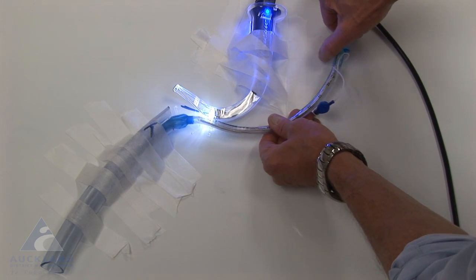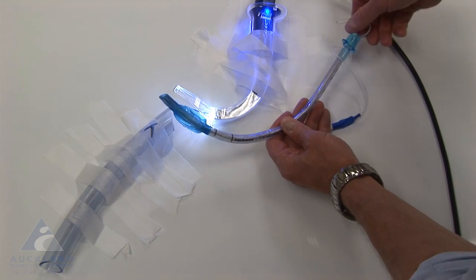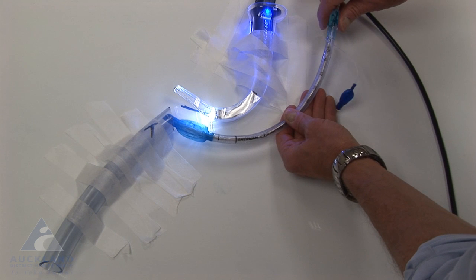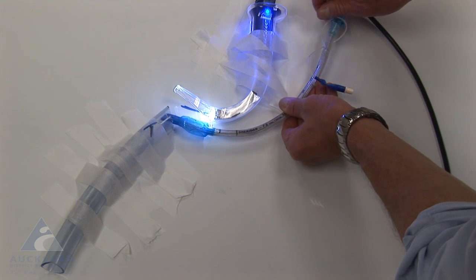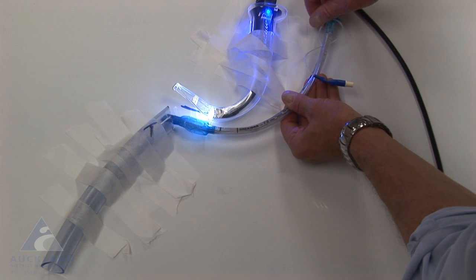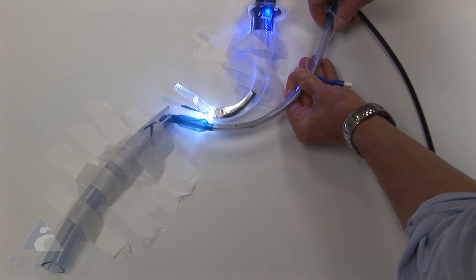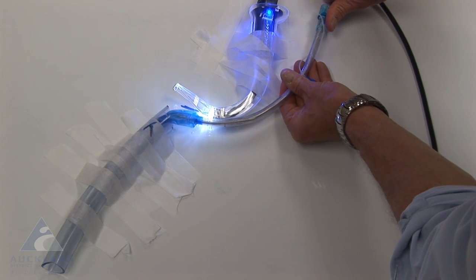So the elements of this again, if we just come back, are a very flexible tip, pulling back the stylet to free up the tip. Once it's in the anterior tracheal wall, it may just go down, but if you spin this tube on the stylet, what will happen is that it will start to go down the trachea. And I'm just going to spin it now, and it will start to go down the trachea, just as I'm showing now.